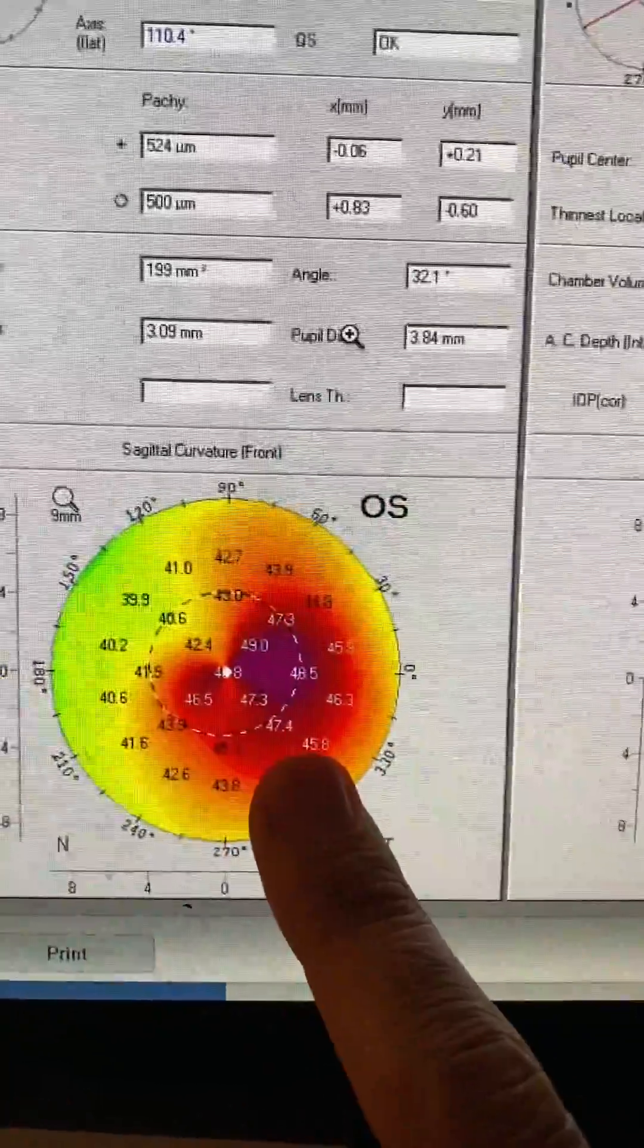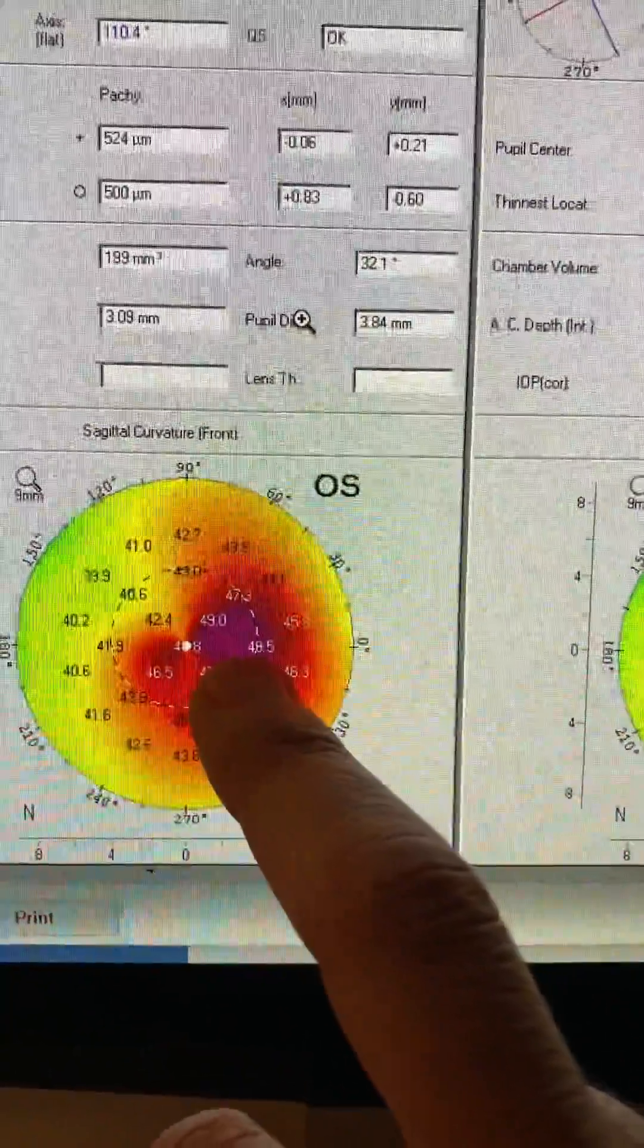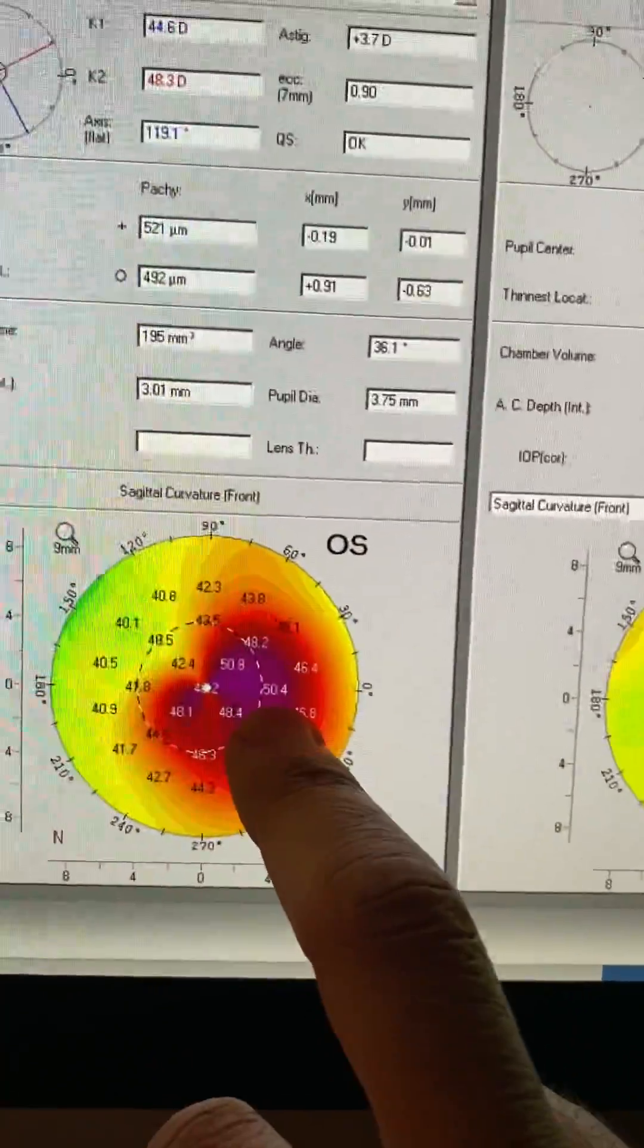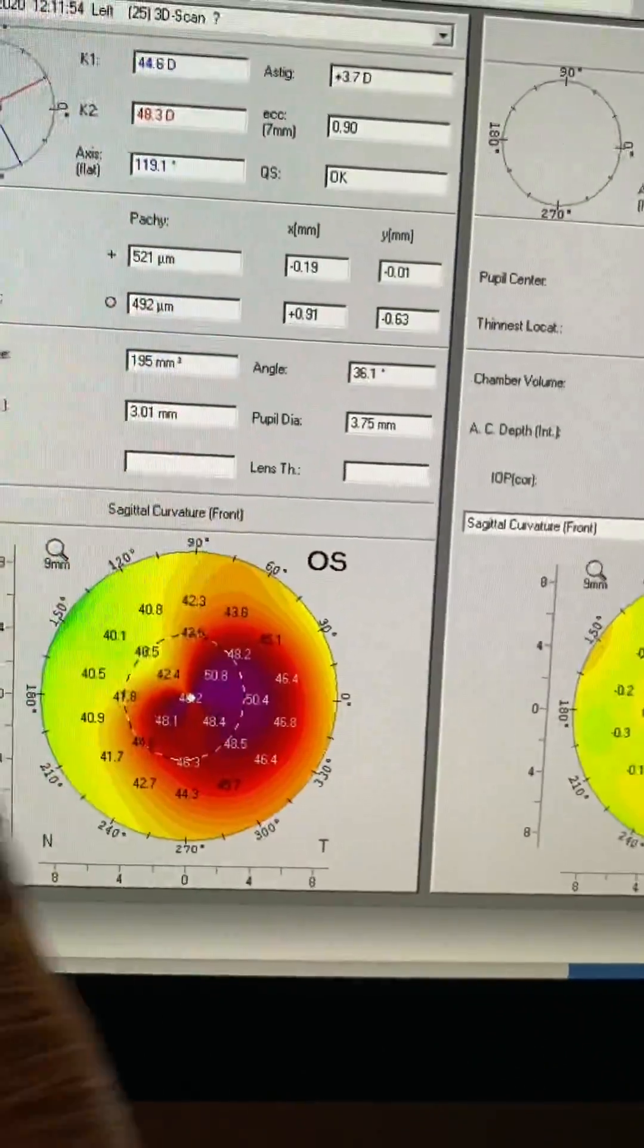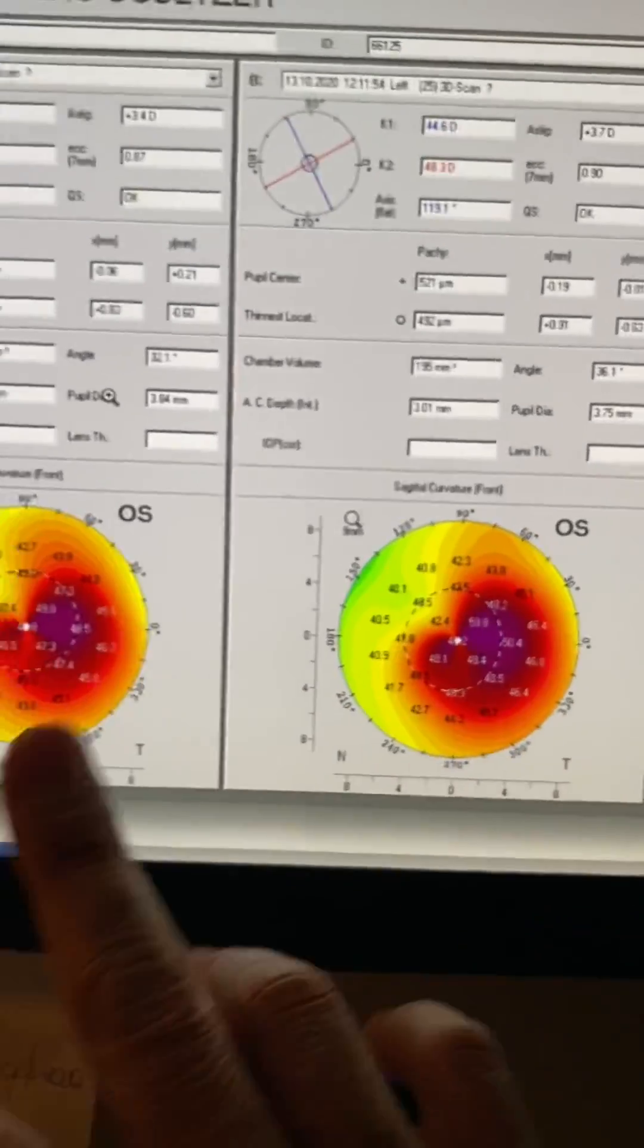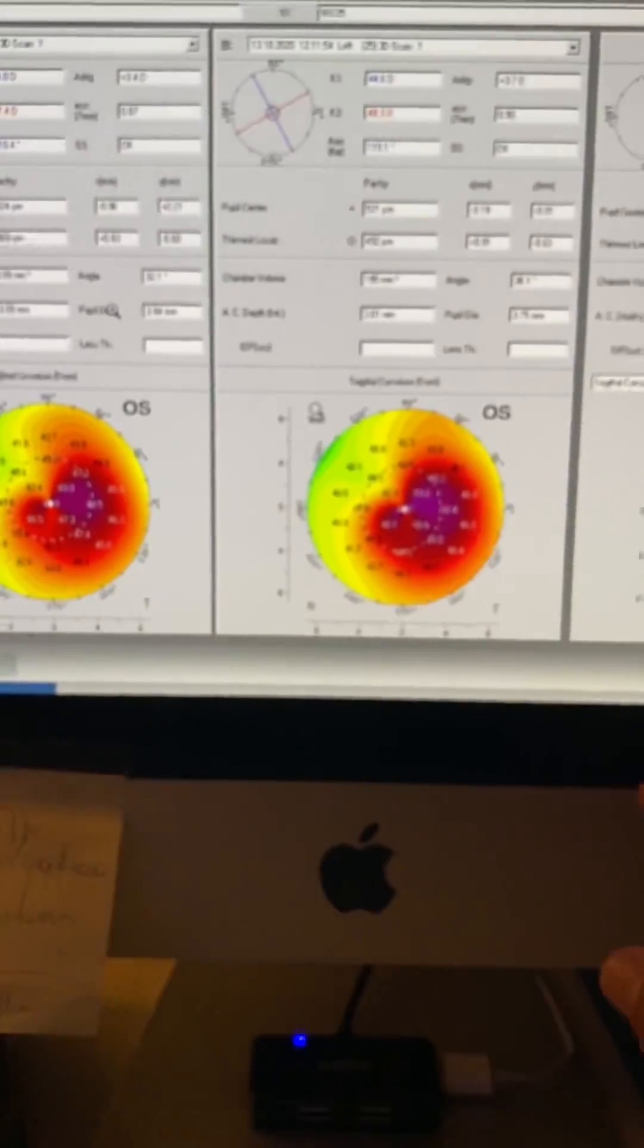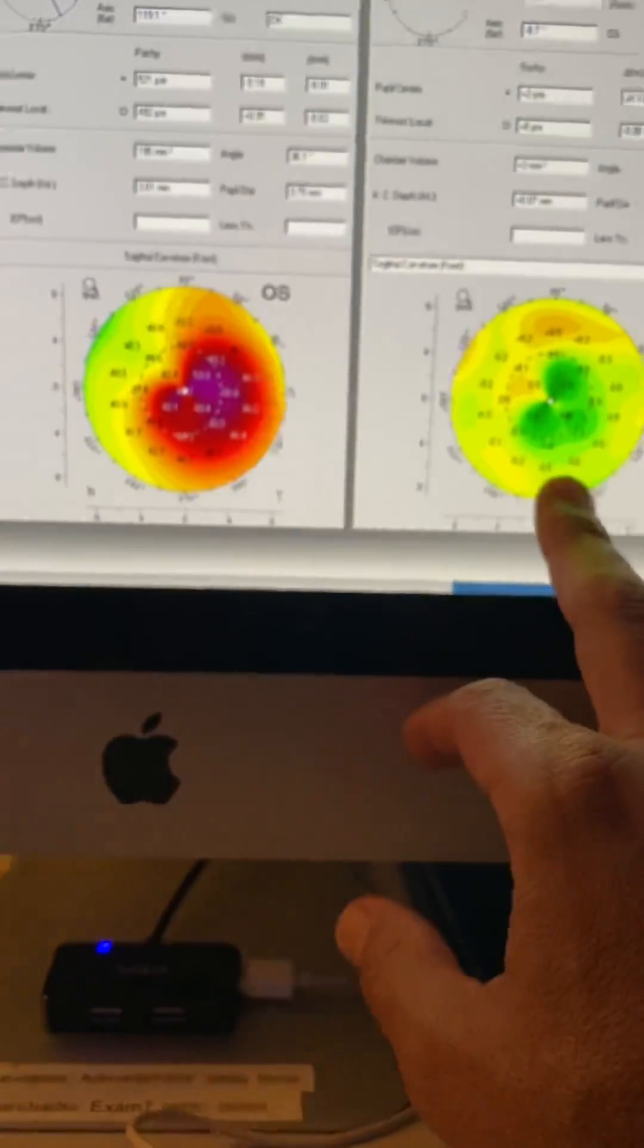We're looking here at steepest K, measuring at 48.5. And this is him today, 50.4. So we have a dramatic deterioration along with the shape of the cone. We can appreciate the differences here showing progressive ectasia at 44.